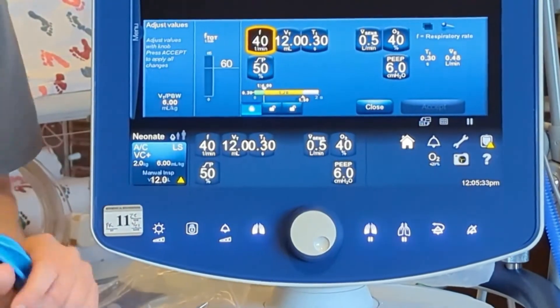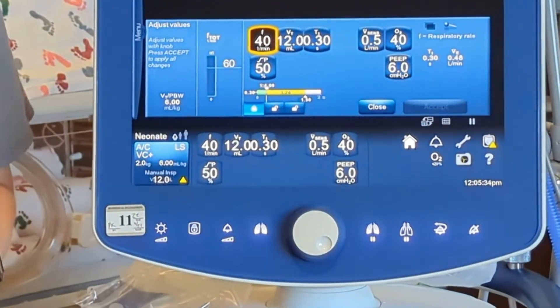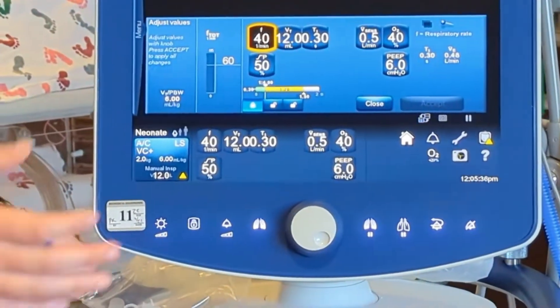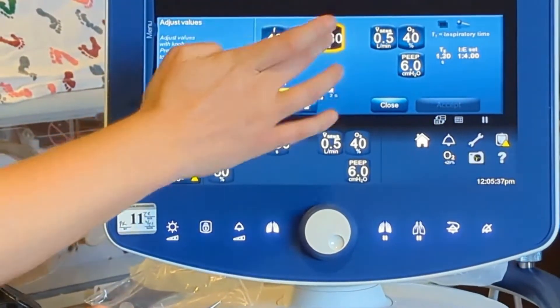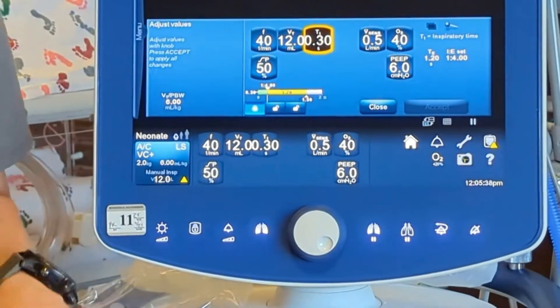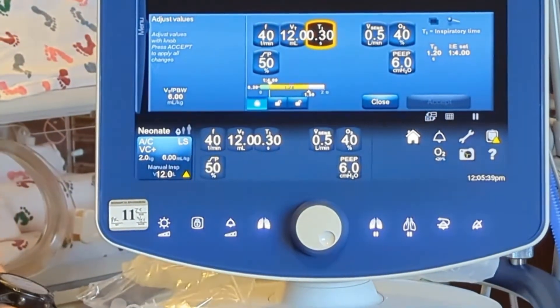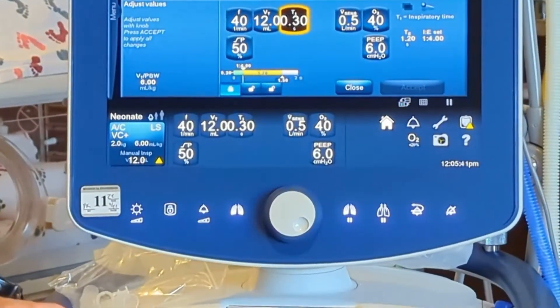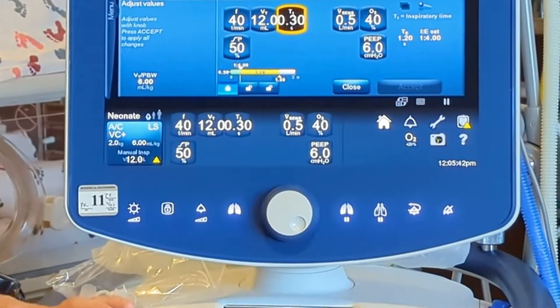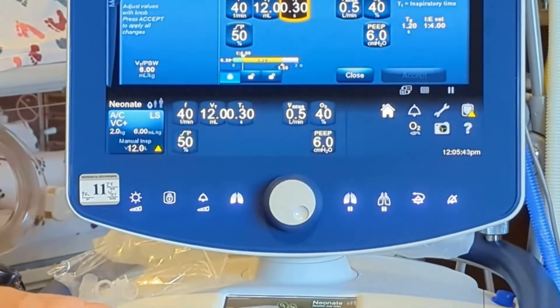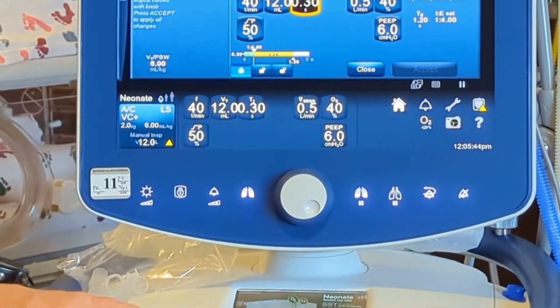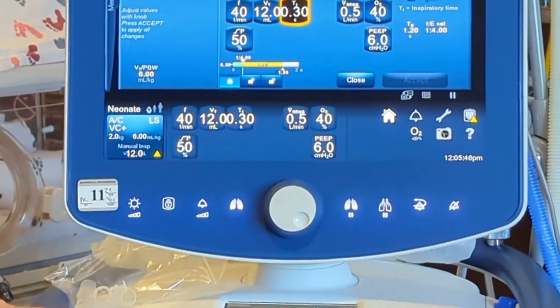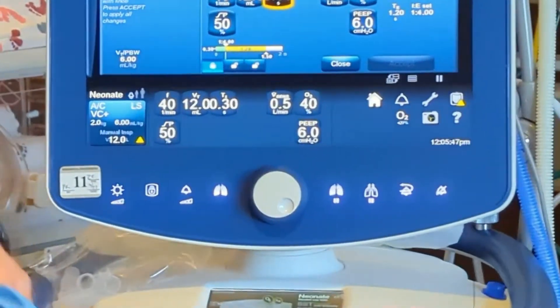Then we'll set our respiratory rate — generally anywhere between 40 and 60. Our inspiratory time depends on the gestational age of the baby, but generally we'll start anywhere from 0.3 to 0.5, normally 0.35.